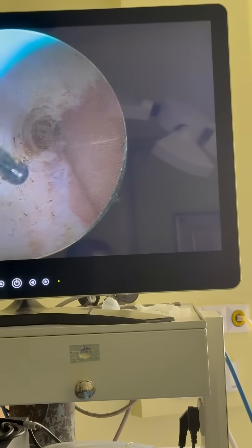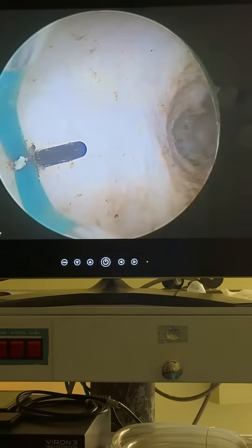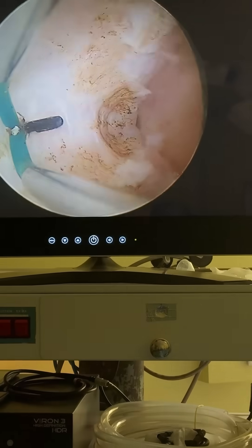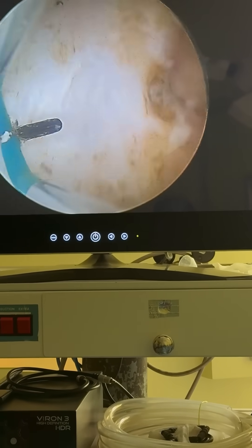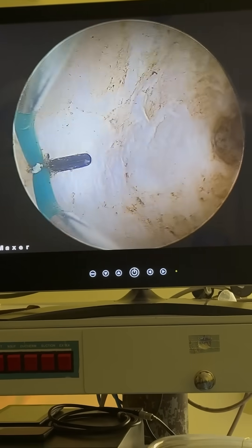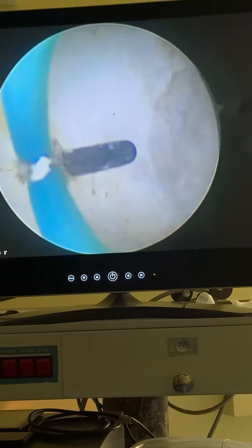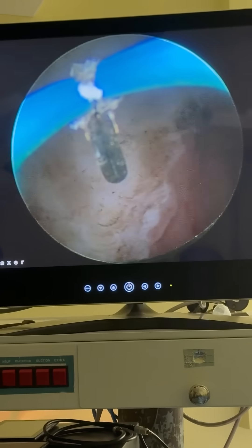When I'm not using the energy source, you can see that I'm just gently pushing the resectoscope manually to separate the fibers. Having the right kind of instruments is very important — this is a 2.9 mm scope with a 4 mm operative sheath. This procedure went very well, and the patient is discharged after four hours.